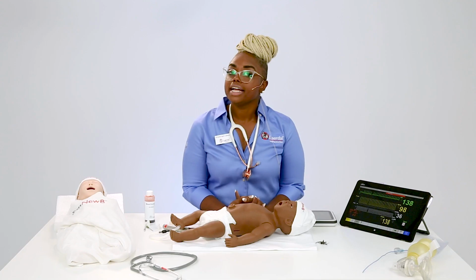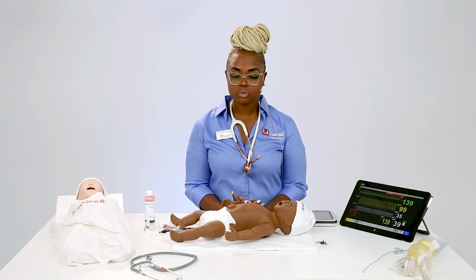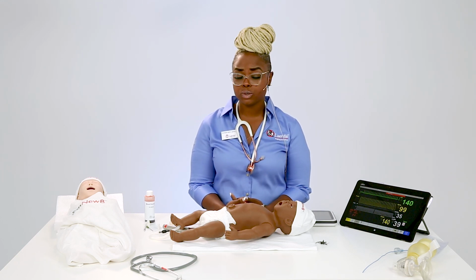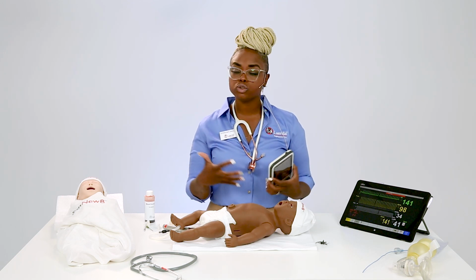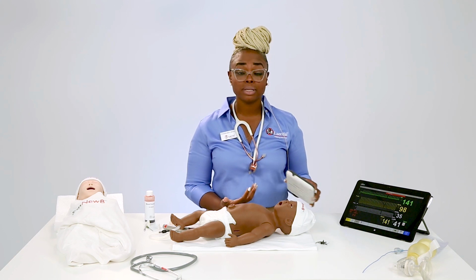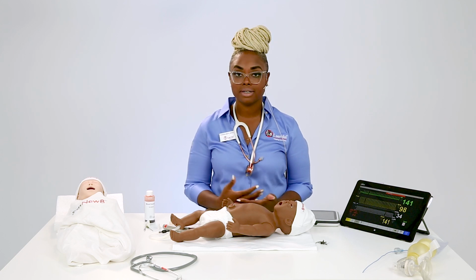Just looking through to see if there's any other questions. Oh, you had mentioned the operating system. Is there an advantage of using Simpad versus Leap? It just depends on your needs. There's not an advantage or disadvantage either way. Portability is more or less what we're looking at. If you want to be on the go, on the move, you're going to want to utilize your Simpad, as opposed to if you have a control room and you're always running your simulations in the same place, you're going to want to use the Leap software on a PC, desktop or laptop. It's the difference between portability versus control room and what your preferences are.